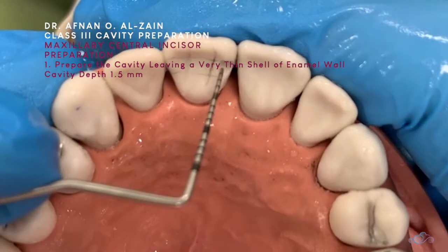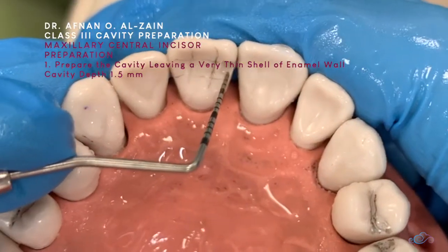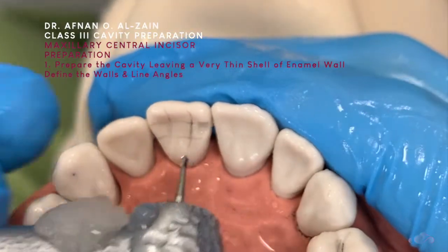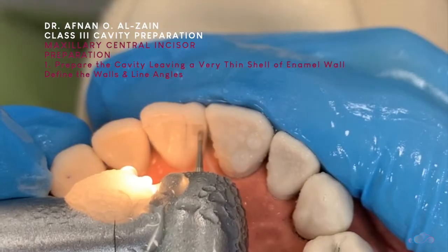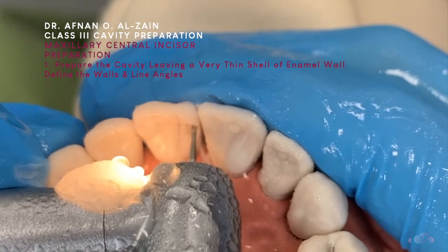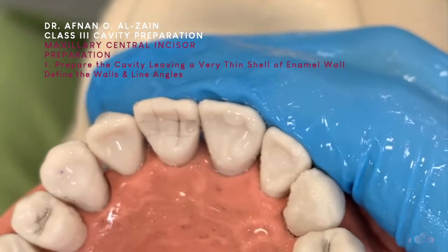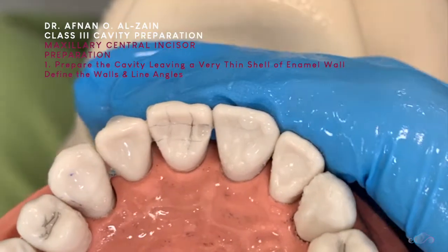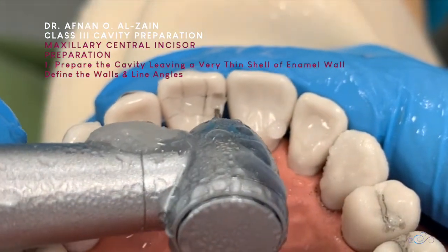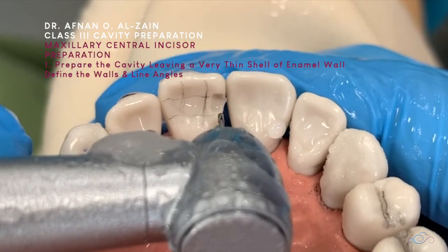The depth is at 1.5, so we're just going to define the walls, and after here, we're going to create a margin of edge. We need to thin this line angle more, otherwise it won't be a straight line here.